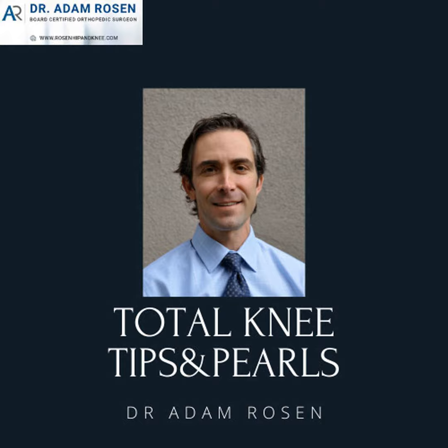So for these, when you're treating these, again, if it's really small, it's still big enough, but it's still smaller than your smallest augment, you might fill with cement or most likely use an augment. You could use bone graft or bone grafting techniques with impaction grafting. You're going to use some sort of modular things such as a sleeve or a cone that you'll fit in there. And I think these have become a lot more common now that they're available.